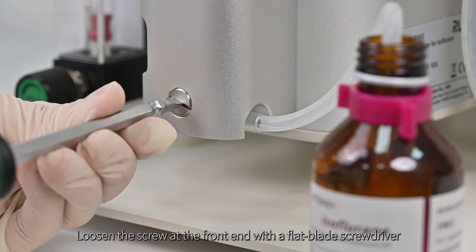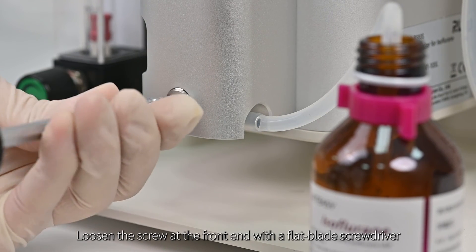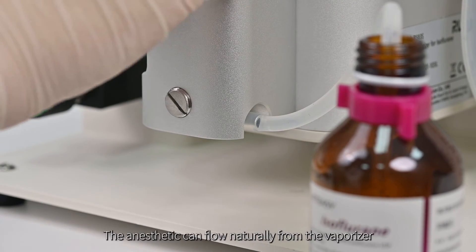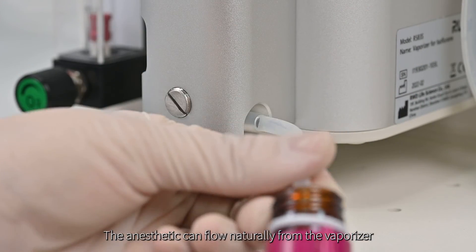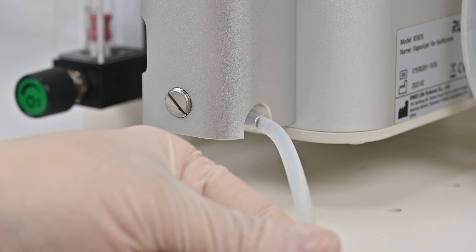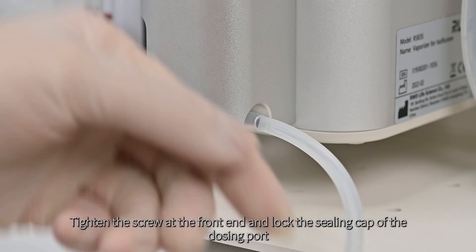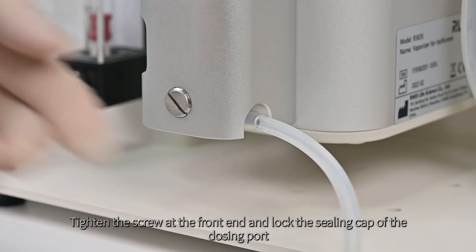Loosen the screw at the front end with a flat blade screwdriver and loosen the sealing cap of the dosing port. The anesthetic can flow naturally from the vaporizer. When no anesthetics flow out, tighten the screw at the front end and lock the sealing cap of the dosing port.